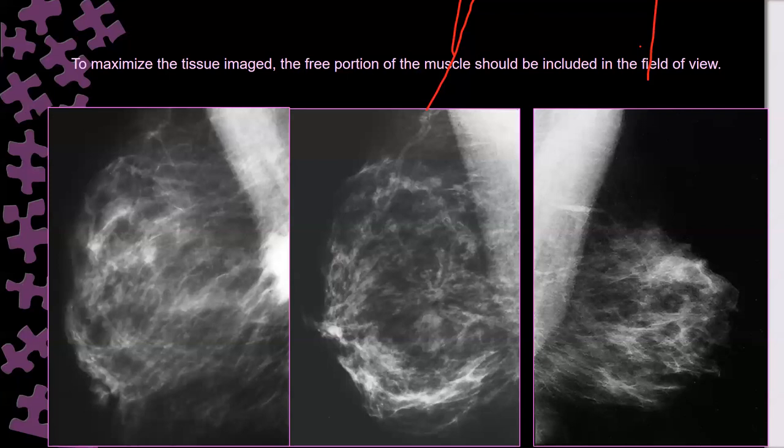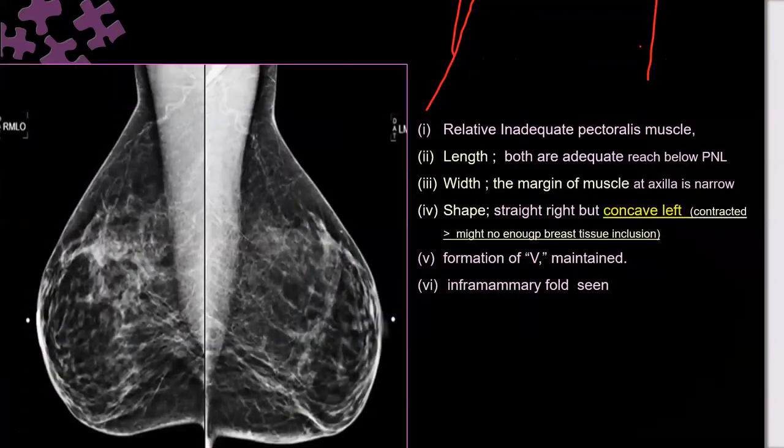Let me look at the image for a moment. The only thing here that you're not happy with is a contracted left pectoral. Yes, contracted left. That is it.